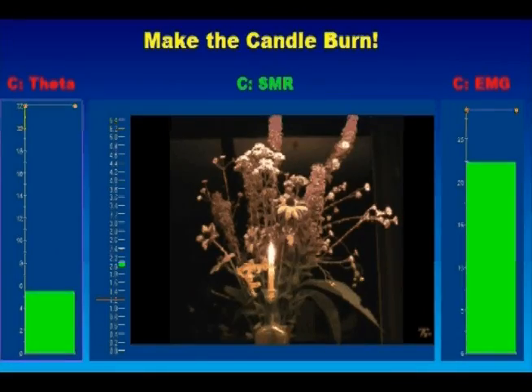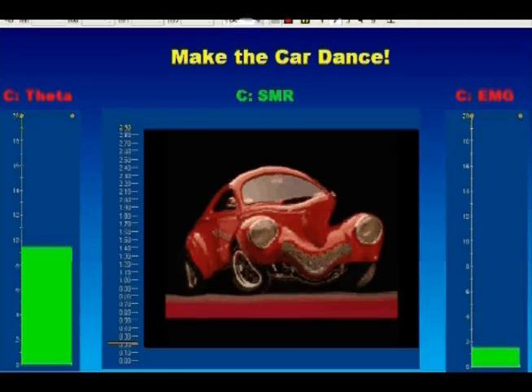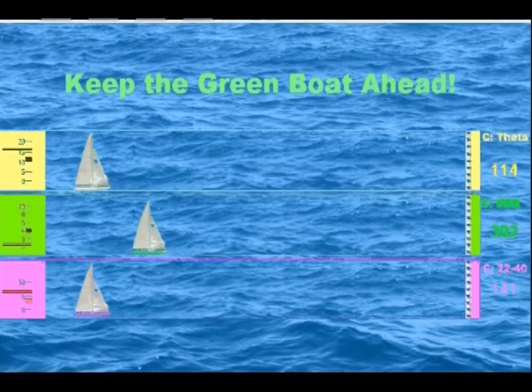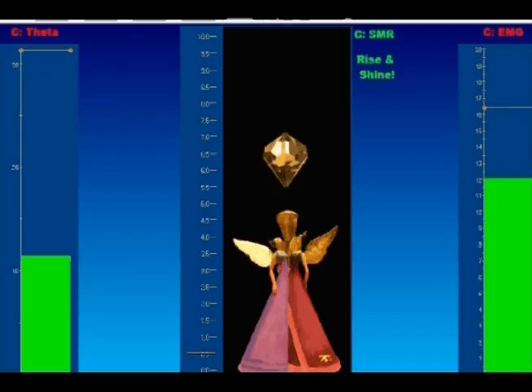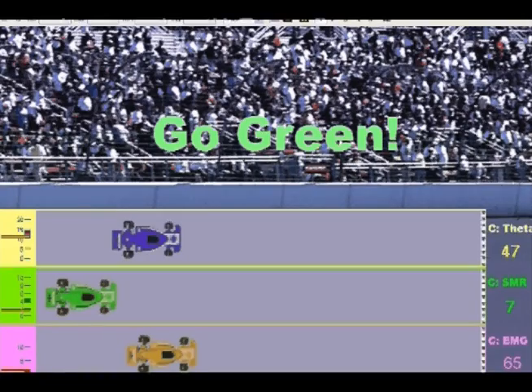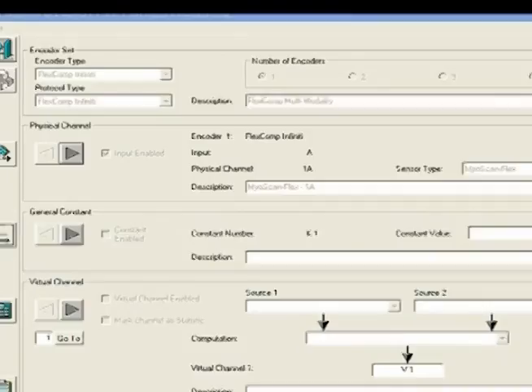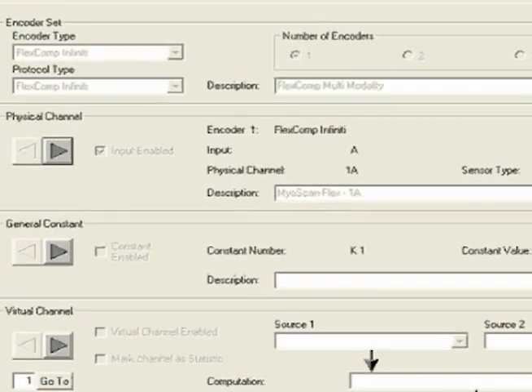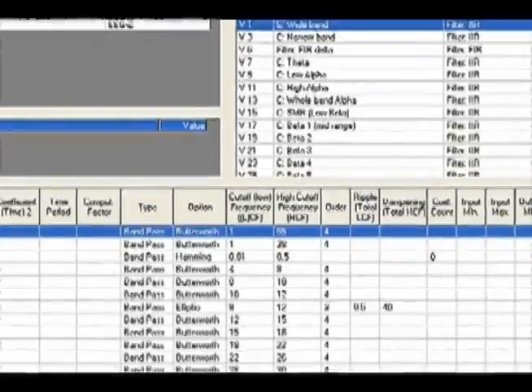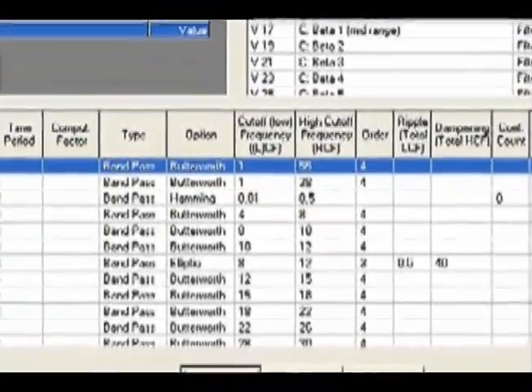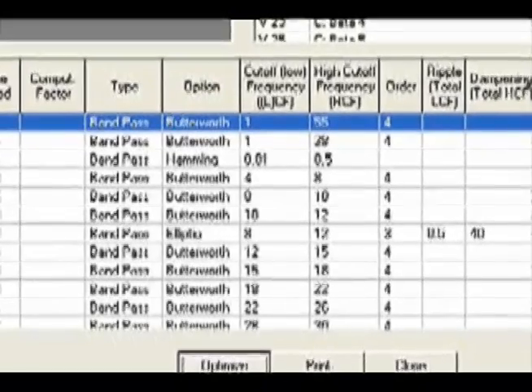These screens illustrate some of the many animations and games. There are over 100 animations which are free with Biograph Infinity, and over 300 optional animations and games available from Thought Technology and third parties. The free developer tool package allows you to customize screens, channel sets, and scripts. The channel set includes 65 algorithms to allow you to create filtering and statistical channels to be used in screens and reports.